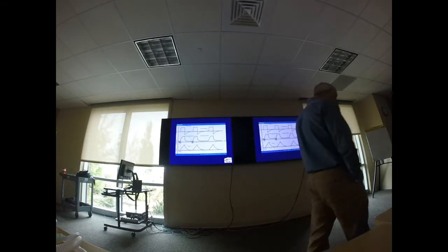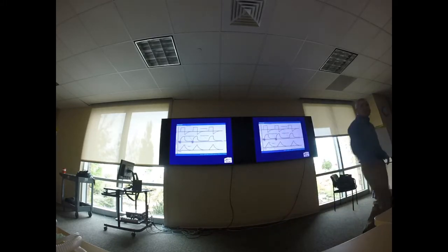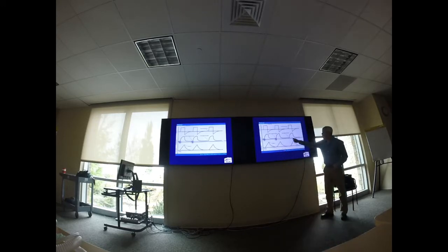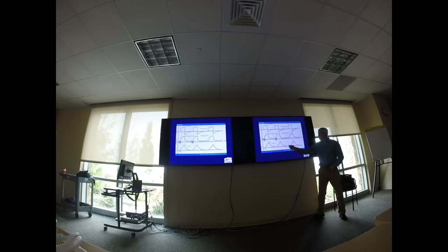So he takes a breath, it gives him the volume that I have triggered. He doesn't take a breath, the ventilator triggers it, he gets the volume that I have set, right? So if I've got 750 set, he gets it whether he triggered it or the ventilator gives it. Does that make sense?